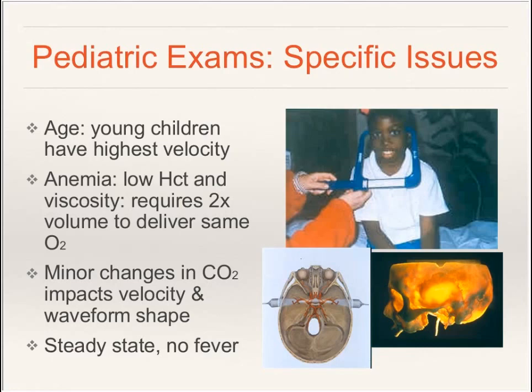You can get these calipers through medical supply stores, and they're usually called obstetrical calipers because that's where they're primarily used. But I think you will see that children between the ages of 2 to 6 usually have head diameters of about 120, and then the kids from 6 to 12 usually about 125. And as you get into your older teenage kids, their diameters tend to be between 125 and 130. So you can just use that as a baseline. And when you're doing your studies, you'll see that this does hold true to form.